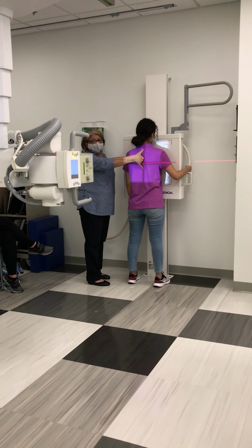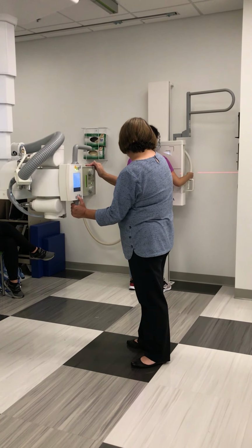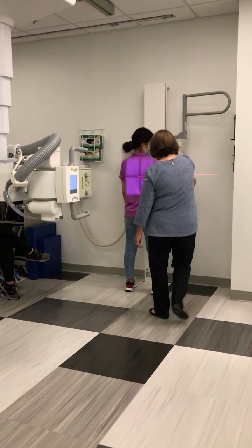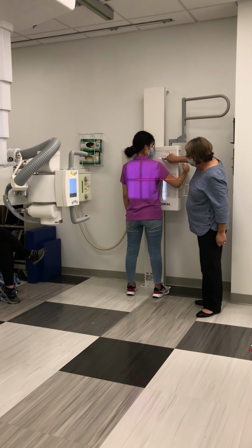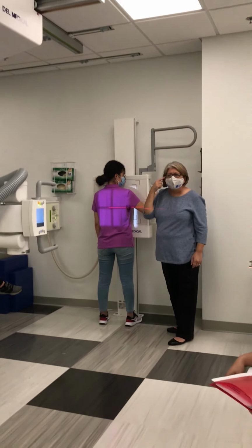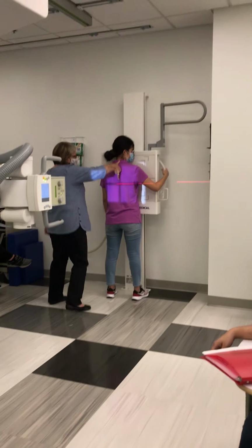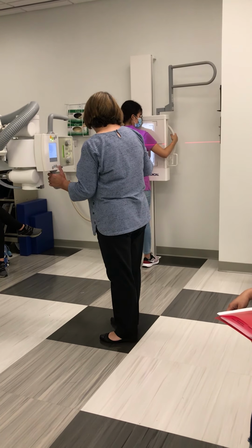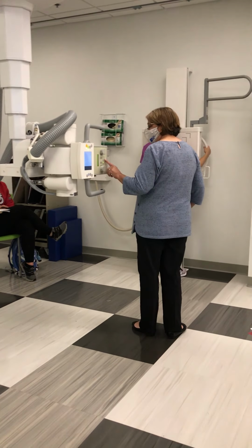So, let's say that I went through this, and let's say that my thumb wasn't on a vertebral prominence, that this is where I measured. And I centered lower. Now right away, go ahead and stand up. Right away, you see I just got like a finger width of light there. Right away that should tell me, oh wait, that centering's not good. Measure again. That's better.